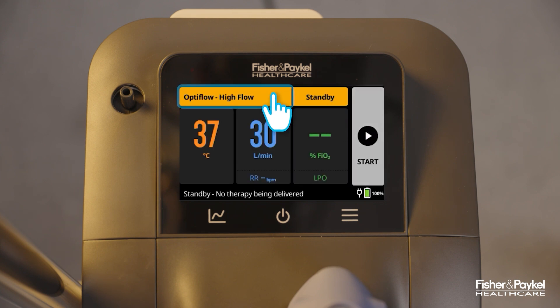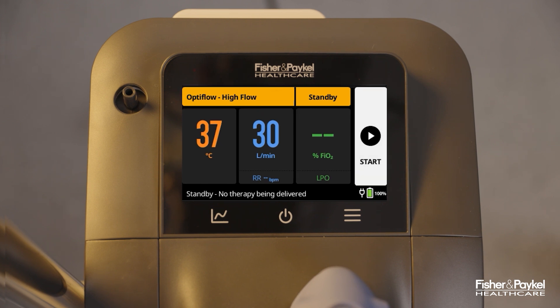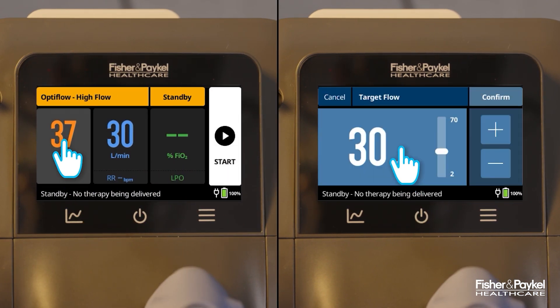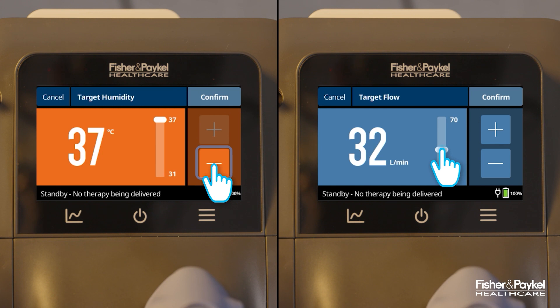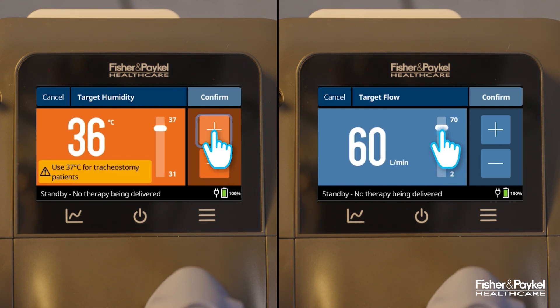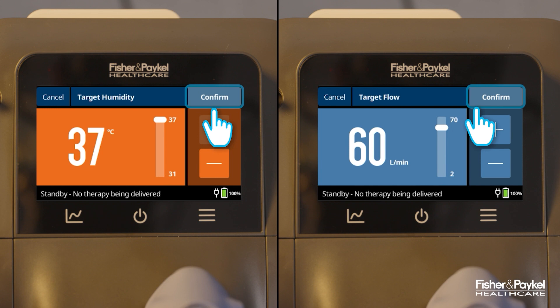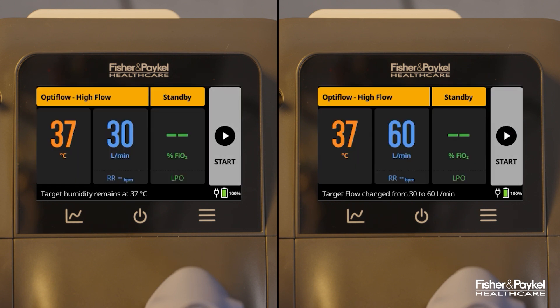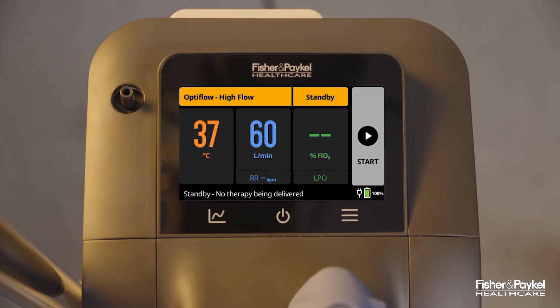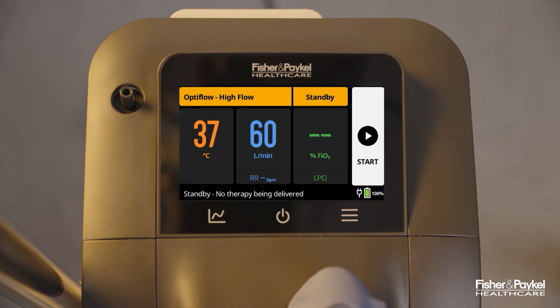Select OptiFlow high flow in the therapy bar if it is not already selected. To adjust the target humidity or flow, tap the respective tiles. Use the plus and minus button or slider to set the desired value. Tap confirm to apply the change, or cancel to discard any changes. The humidity and flow tiles on the home screen will display the target therapy settings. Tap the start button to begin therapy.